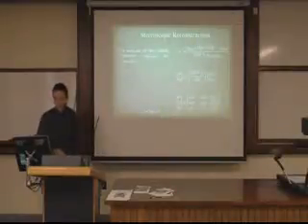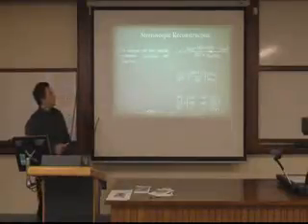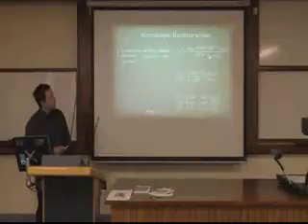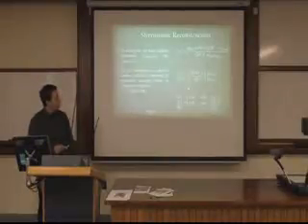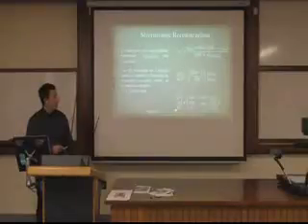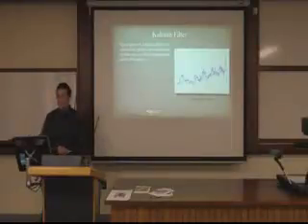And so once we have these endpoints, then the stereoscopic reconstruction can occur. You can see here that first of all we get the Y dash value, which uses the geometry of the LINAC, the SID, and both the X locations of the marker in image 1 and image 2. So that's using the orthogonality of the two images, and from that you can reconstruct the X and Z. Then it has to be projected back from rotated gantry coordinates into the LINAC fixed patient coordinates, and that's just another rotation matrix.